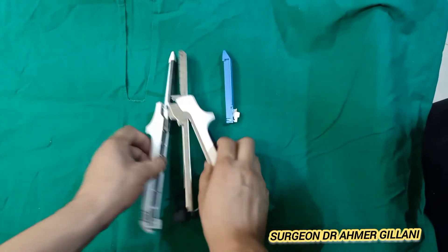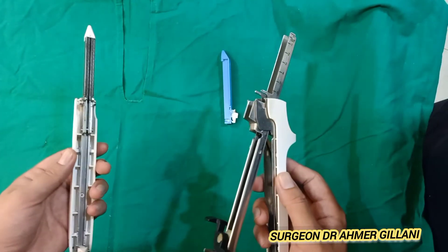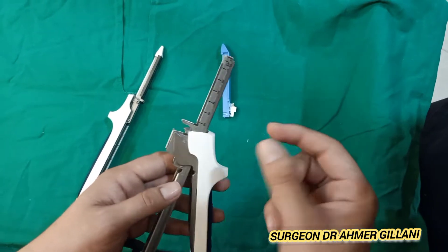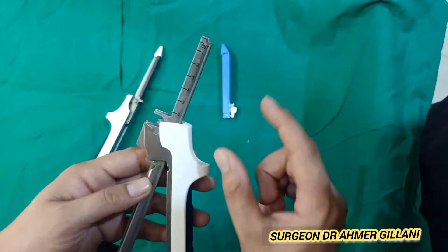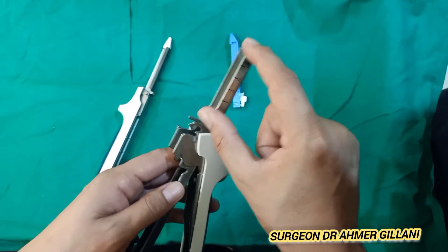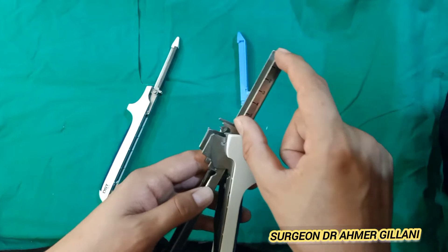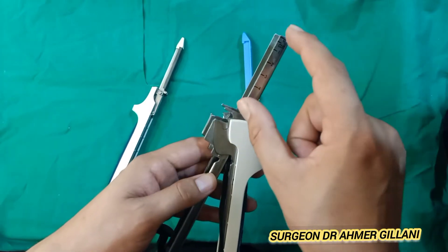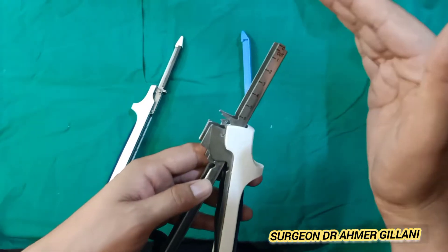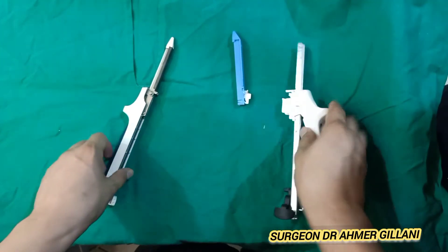This is the linear stapler and it comes in various sizes like 60 and 80. The size depicts the size of the anastomosis. If the length is 60, it will make an anastomosis of 60mm, and if it's 80, it will make an anastomosis of 80mm length.